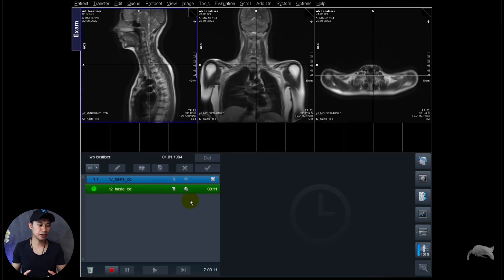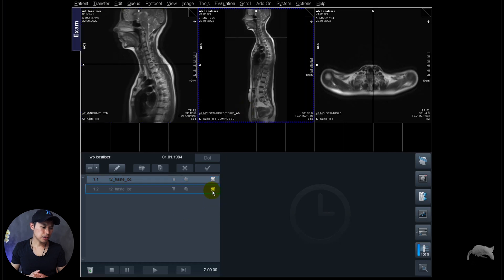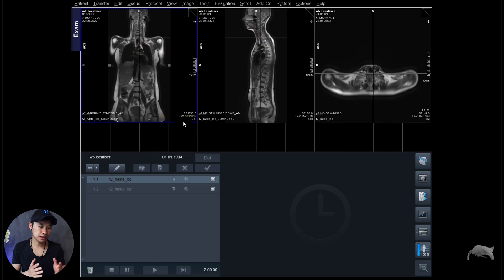So zero on the first step is perfect. So let's check number two. You see it moved down around almost 400 millimeter towards the feet. So it's stitched together, it's very robust, it works and as long as the patient is lying inside the scanner in the middle of the scanner, this will work perfectly.